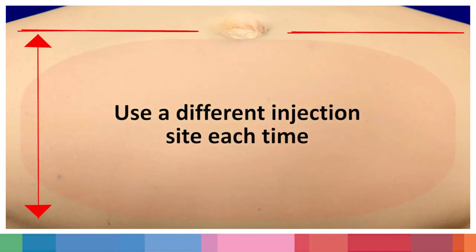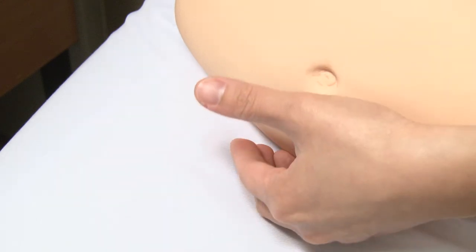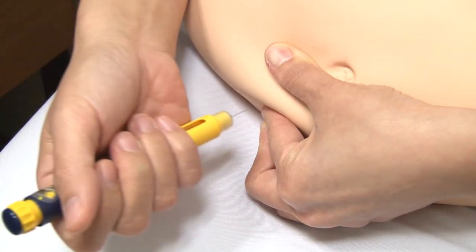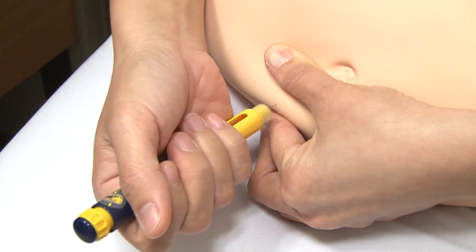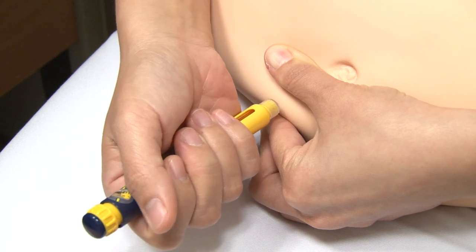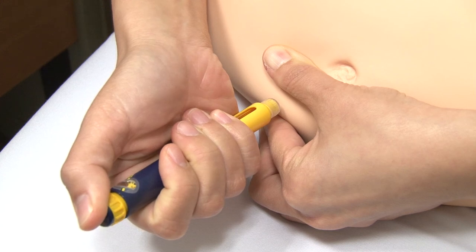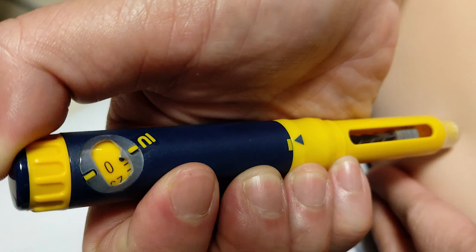Use a different injection site each time to lessen the chance of damage to the tissues under the skin. Firmly pinch the skin with your thumb and index finger and hold it. Hold the injection pen with your dominant hand and ensure that your thumb can reach the injection button. Inject the needle into the pinched skin at a 90 degree angle and slowly push the injection button until the dosage marker reaches zero. Wait for 5 seconds.